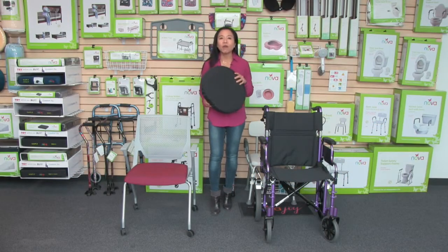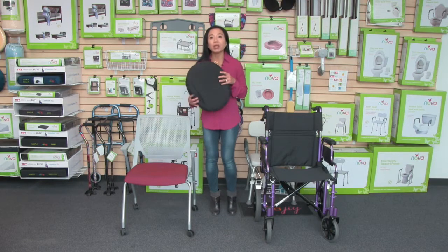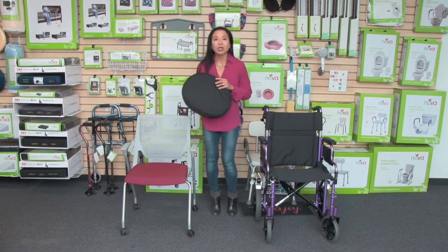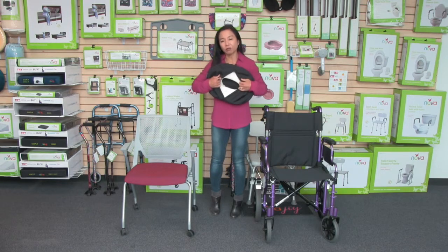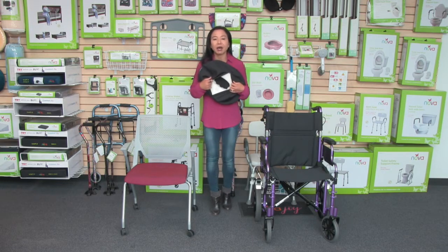Hi, this video is about the Nova donut pillow with the egg crate foam. We call this a donut cushion because it's in the shape of a donut on the foam — the circular area is cut out and that relieves pressure from sensitive areas.